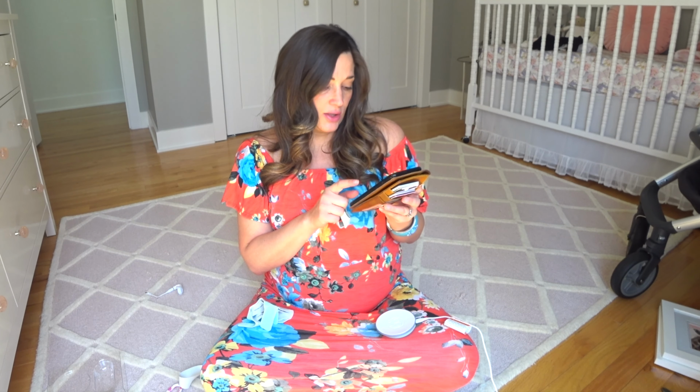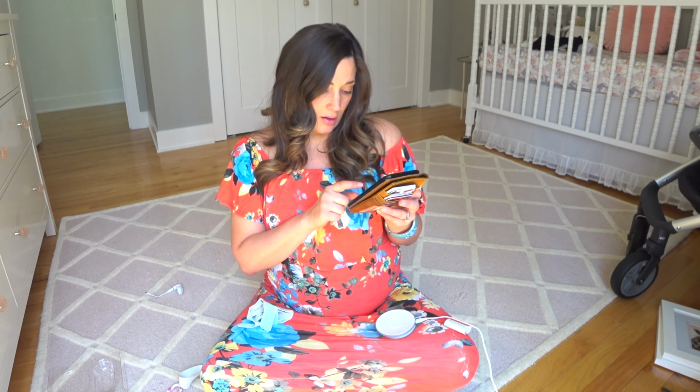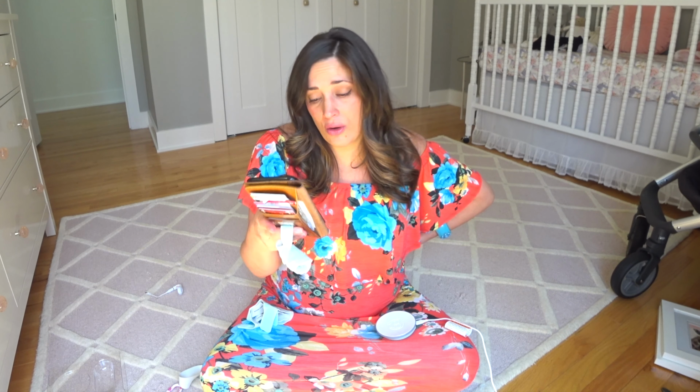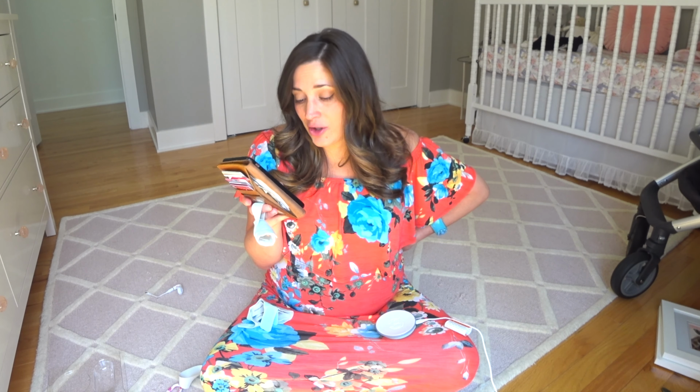So you don't want to cinch it too tight, it says. You don't want it too big. It's like Goldilocks. You want it just right. So they're just saying, like, sock fit is important, people. Incorrect use of the sock could result in red marks, pressure sores, or blisters on the baby's foot. And then you have to click I understand. Sock fit is crucial. Please watch this video as a reminder of a few key Owlet how-tos. I think I will watch this later, and we will click next.